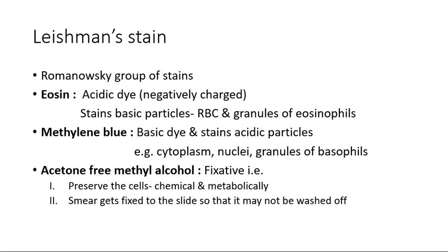All the processes will stop at that same point. And the second thing is we want that smear to get fixed on the slide. So these two roles are played by acetone free methyl alcohol. This is all about Leishman stain.